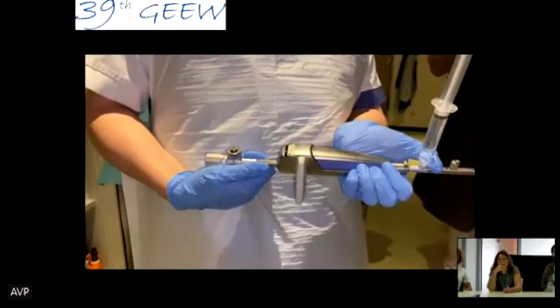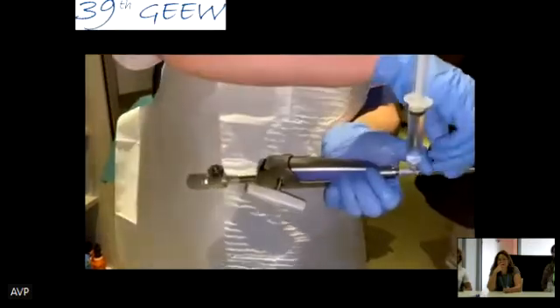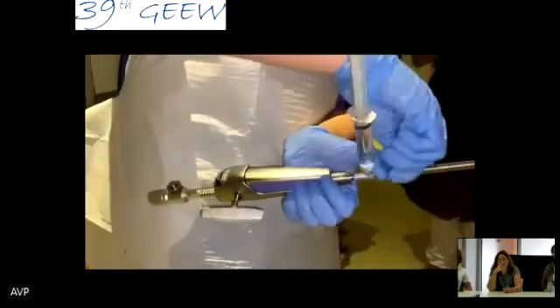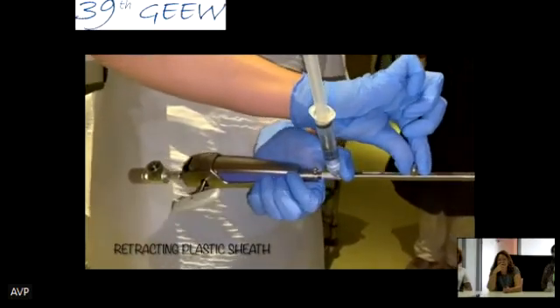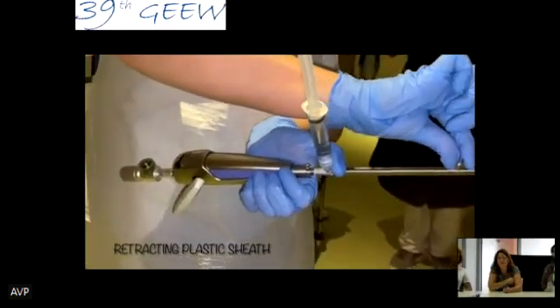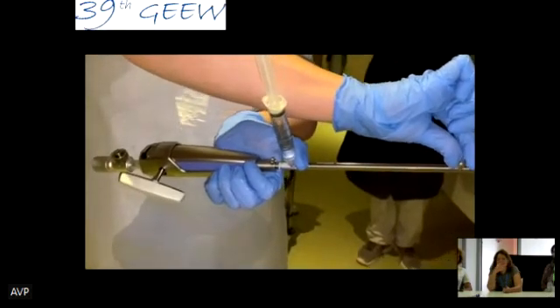And we also have a real case. So now we're advancing the metal sheath over the plastic sheath.